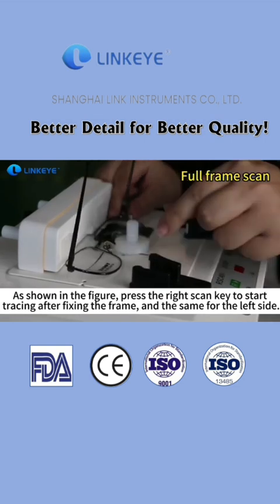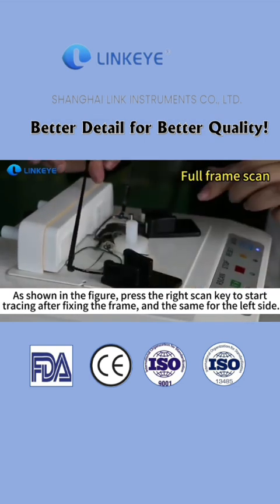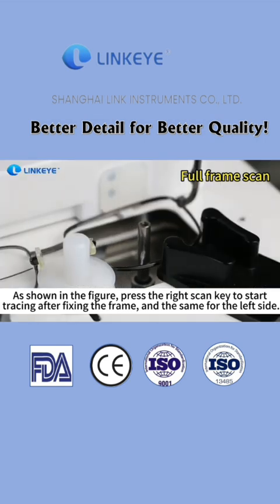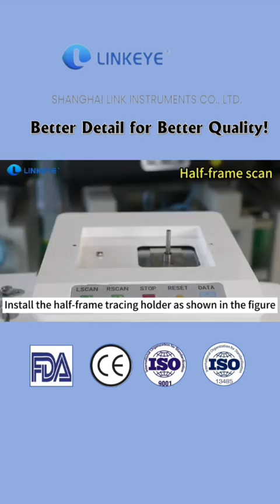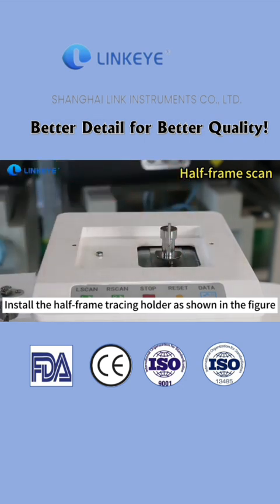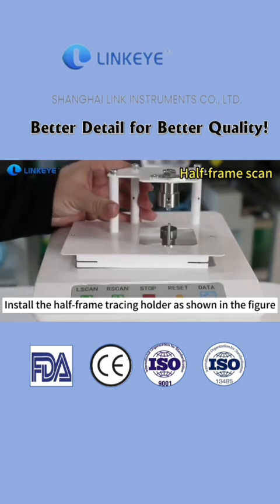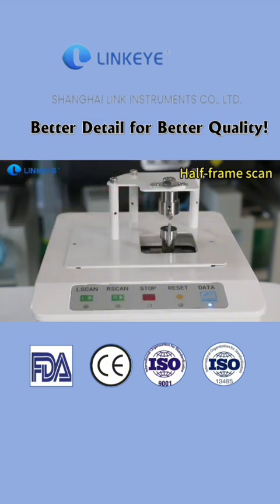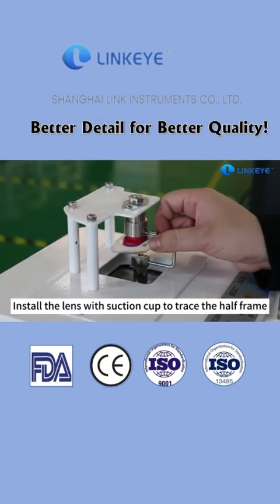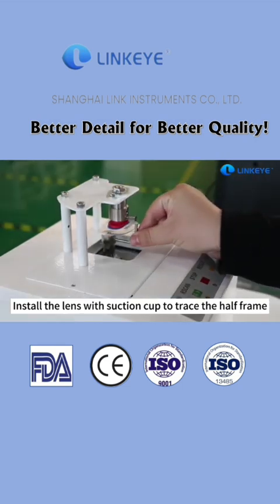As shown in the figure, press the right scan key to start tracing after fixing the frame, and the same for the left side. Insert the half-frame tracing holder as shown in the figure. Insert the lens with suction cup to trace the half-frame.